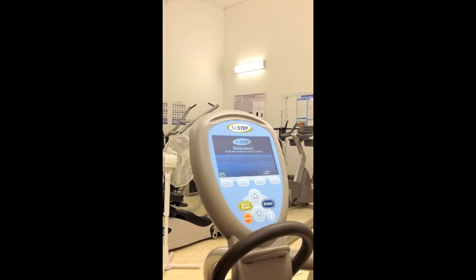To begin using the NuStep, push the Quick Start button. Immediately this welcome screen appears. After a few seconds, this main screen appears and you can begin using the NuStep. For the Submax Test, push Change Program. Using the down arrow, scroll through the menu until you reach Constant Power, then push Enter.